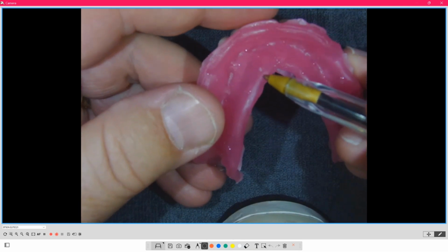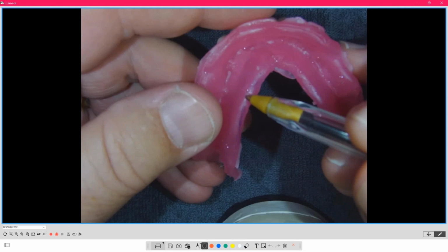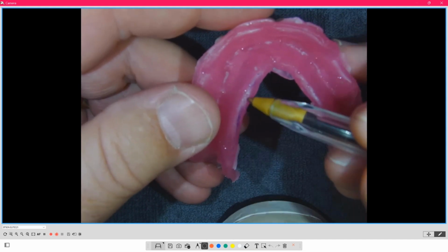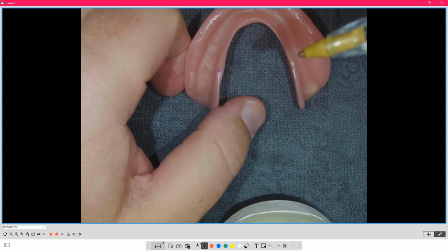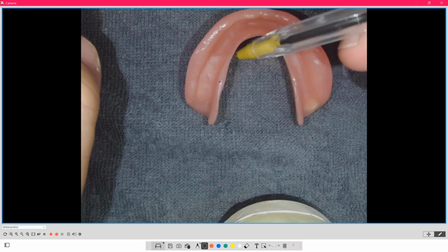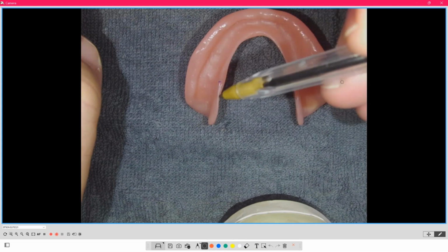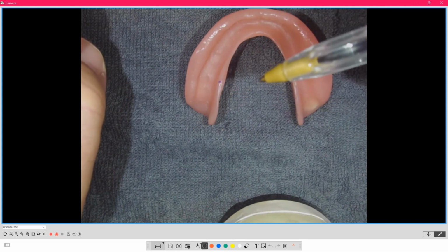So you can actually see it on the wax here. There's that S curve. I trim out in here and turn that thing into an S, and the problem goes away. And I do not have that problem anymore. So a little bit of experience and bashing my head on the wall that I share with you now: please, especially the dental technicians listening, carve in that S curve, please, and that problem goes away.